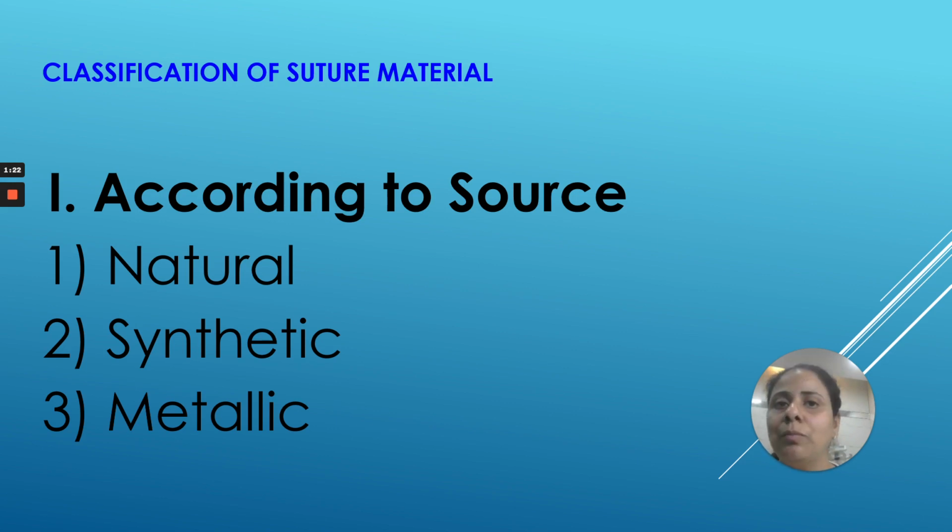what kind of material it is, what the different properties of the materials are, how can you use it effectively in the oral cavity? So if you find it a little boring, you can skip the video, but I would suggest you at least go through it once, so that you know what kind of materials are preferred in the oral cavity and why. So let's jump on to the classification of the suture material.